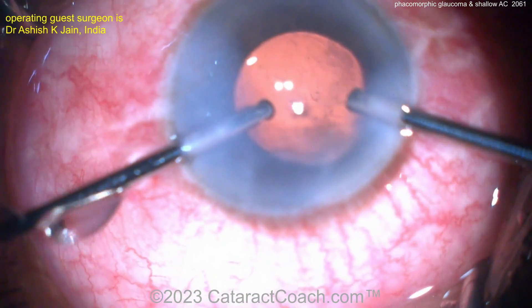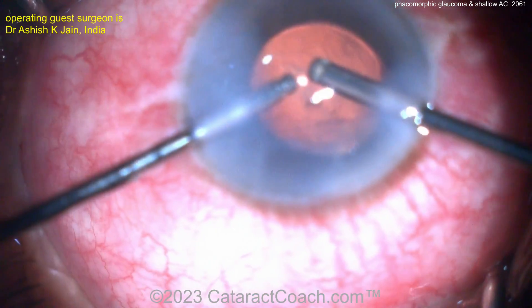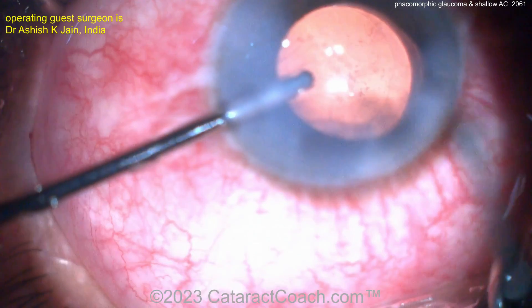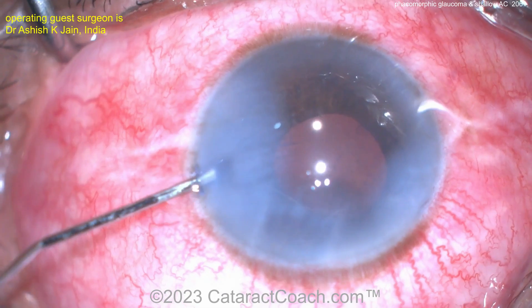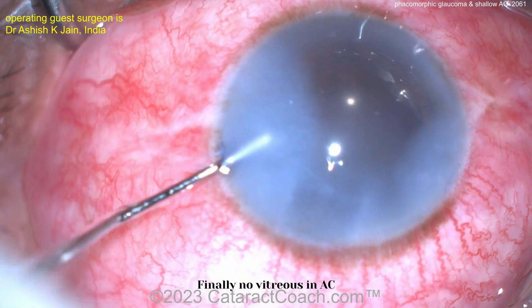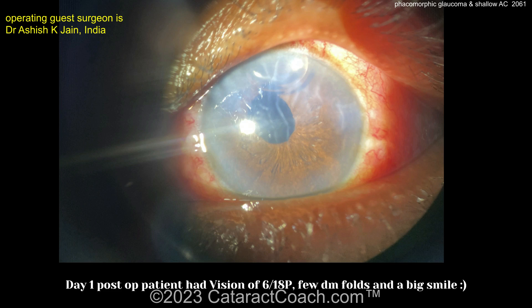Good job there — this is a tough case. Remember, patients who present with phacomorphic glaucoma and chronic angle closure, or even recent acute angle closure, can have induced zonular weakness. And so you saw it here — that zonular dialysis — beautifully managed by our surgeon. A little miotic agent is placed in the eye as well. And finally, finish that case. Very nicely done. No vitreous in the AC. Beautiful result post-op. Patient will do great.